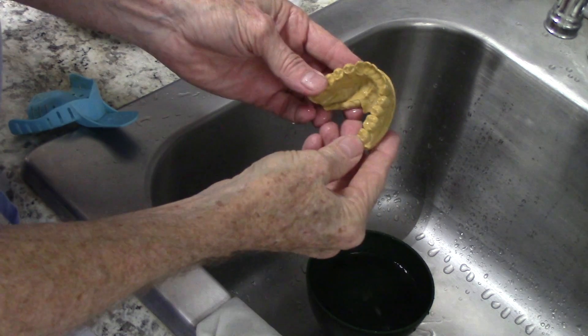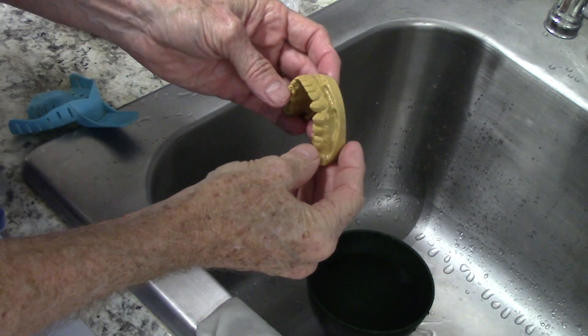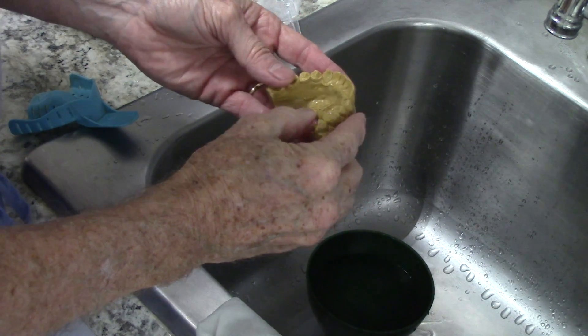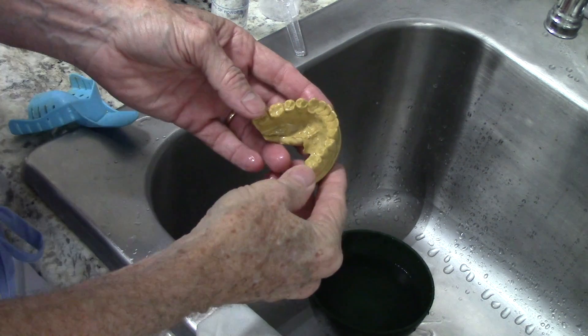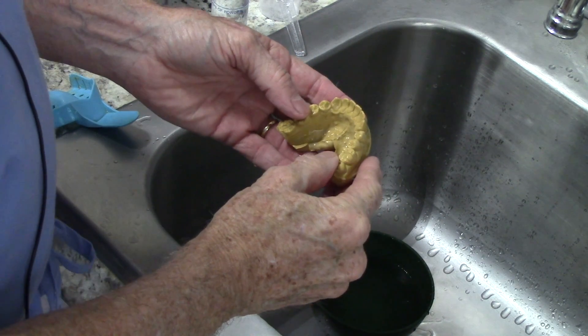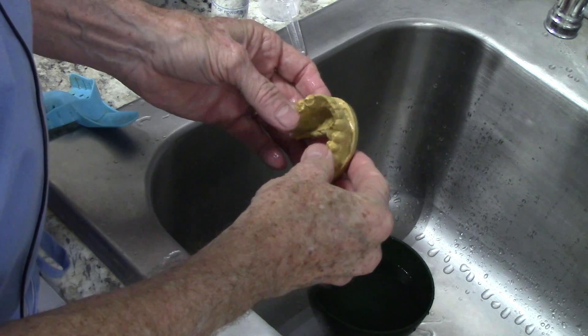Here's my model — it's a lower. I've been soaking this model, and the reason I soaked it is so that it gets all the bubbles out. If you don't get the bubbles out, when you put the impression material on it the impression material will go into the porosity of the model and then it'll be practically impossible to get it off. So I soak it.